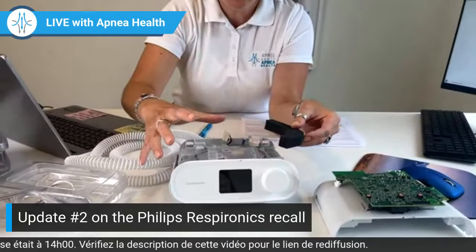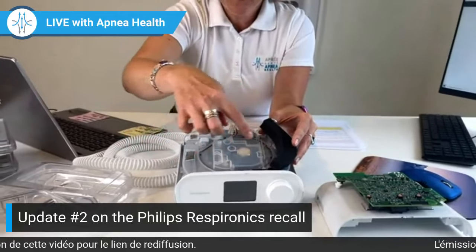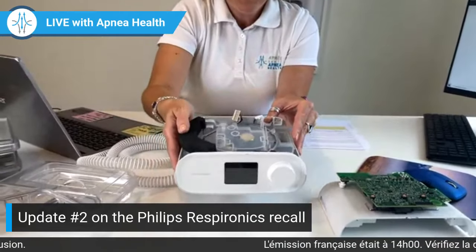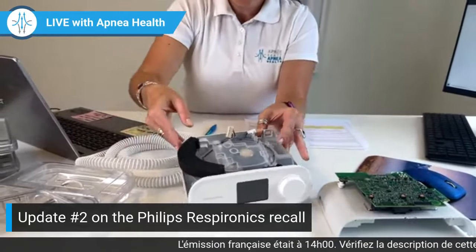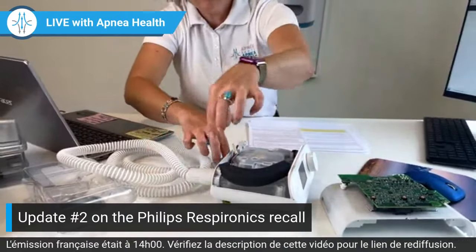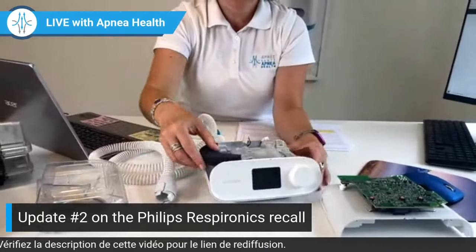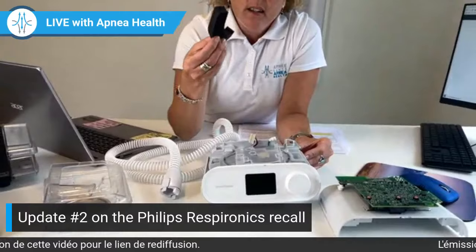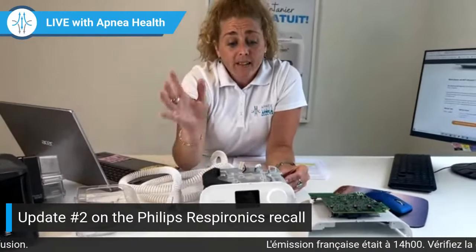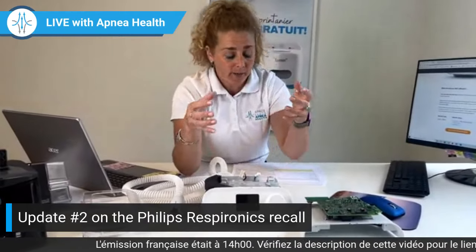I'd like to mention also, the foam is in the compressor motor, and there are two sides. All right, there's two sides of the foam. So this is what it looks like, and all the air will pass through here, circulates in your tube, and goes out like that in the tube. So yes, that's why they say that the foam can be inhaled. That's exactly why. I hope you guys understand that. I wanted to mention that for you to see why it does that.